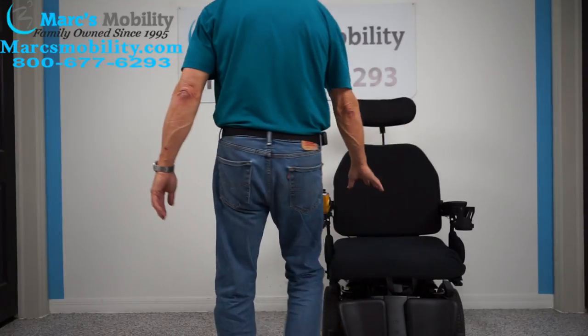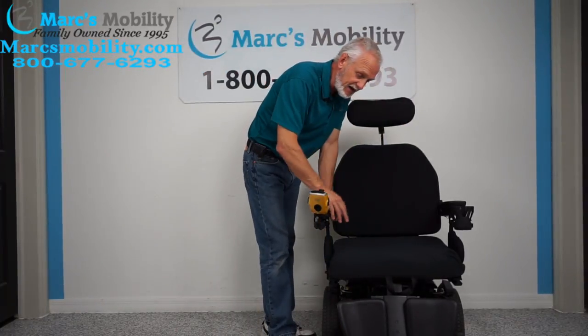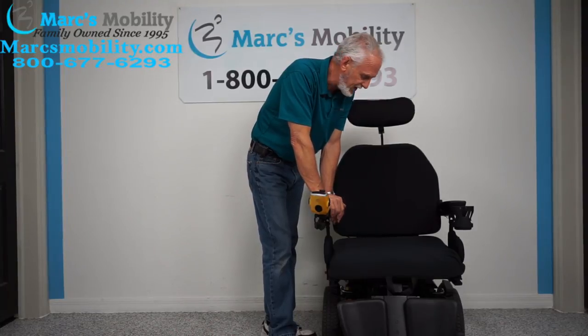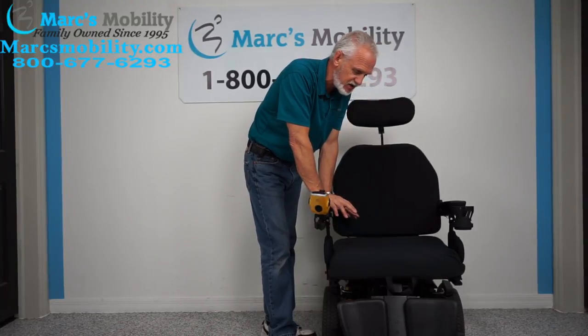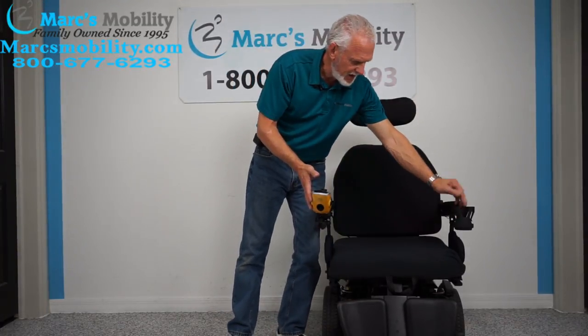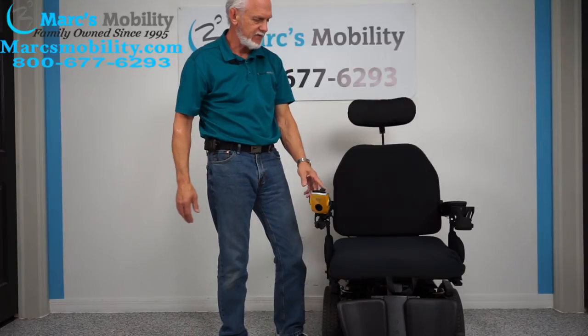We can change the cushions on this chair, but this chair will probably stay as-is since whoever buys it will want a big seat. If you have any questions on this chair, give us a call — we'll be glad to help. If you're left-handed, we can switch the joystick to the left and put the cup holder to the right.